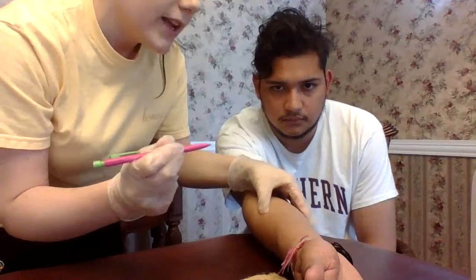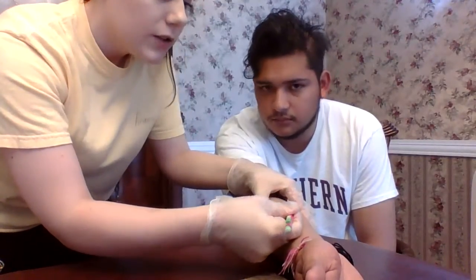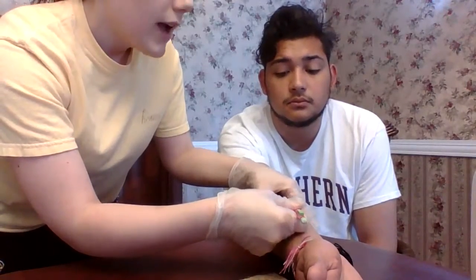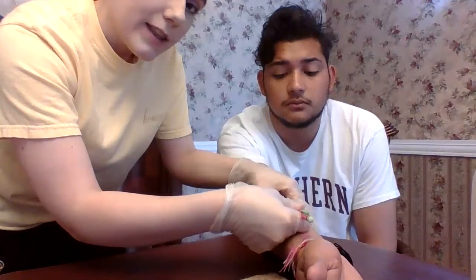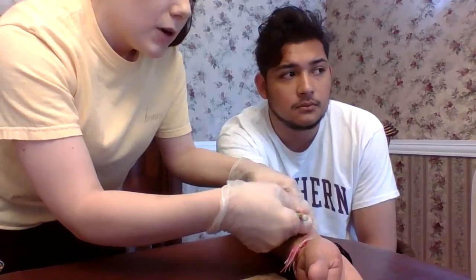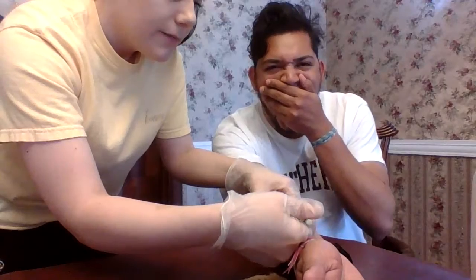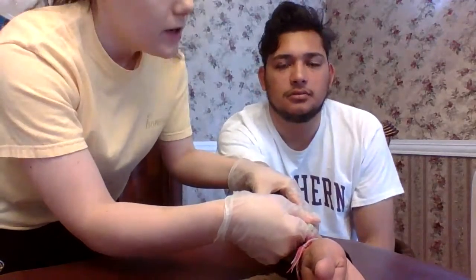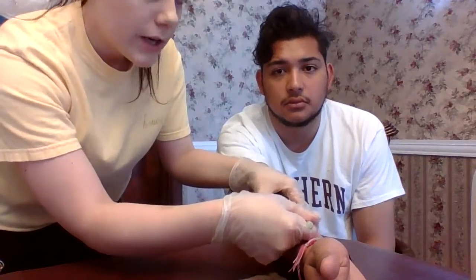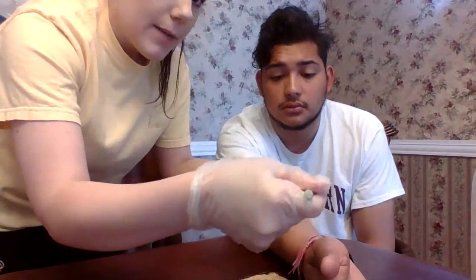I'm going to spread the skin taut. I'm going to hold it at a 5 to 15 degree angle so that the syringe is almost touching the skin. You're going to feel a slight pinch, okay? I'm going to inject the needle 1/8 of an inch in, so it's all the way up to the bevel. Once it's injected, I'm going to slide my hands to this plunger, and I'm going to inject slowly until I see a wheal appear. So I'm going to inject no more than 0.5 milliliters, which would be the dose. So once I've seen the wheal, I'm going to remove at the same angle that I came in at.